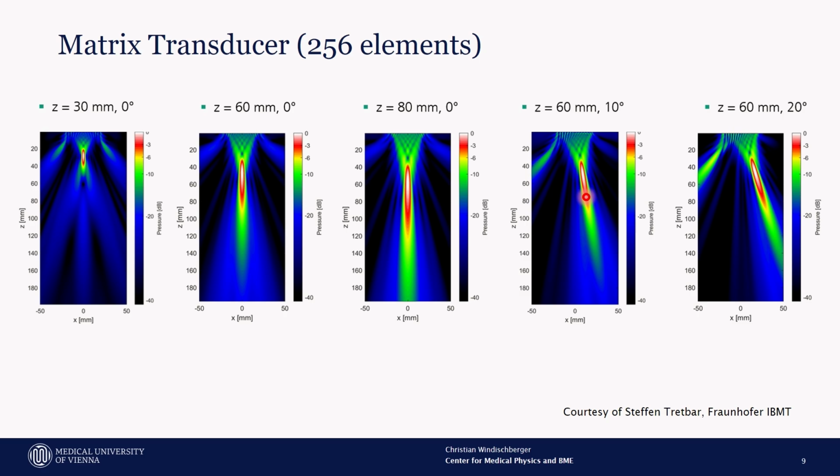So these are so-called steerable transducers. And they are very, very beneficial because, in this case, you are able to reach areas in the brain, your target regions, not only by changing the inclination of the transducer on the head, but by simply changing the stimulation parameters, right? So these are steerable transducers.